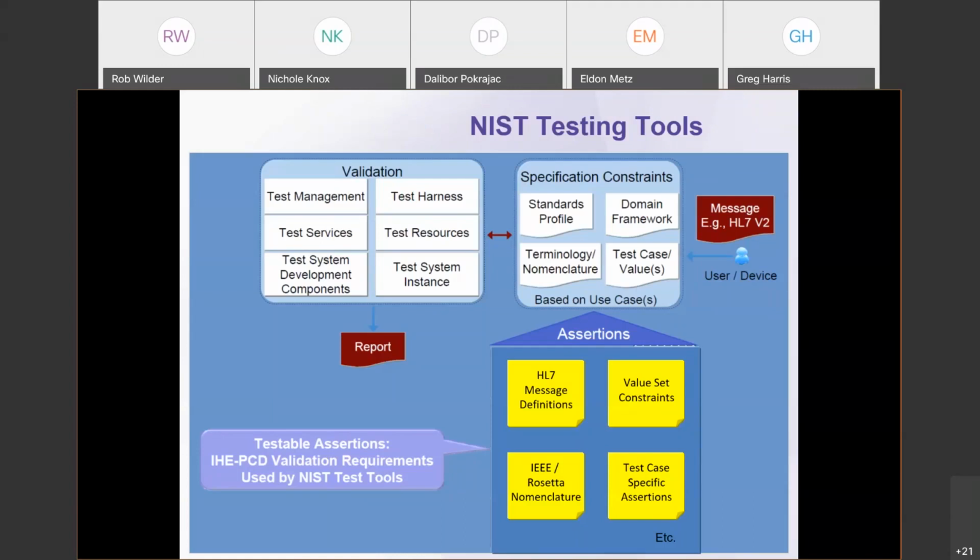The National Institute of Standards and Technology, or NIST, partners with the IHE, and they create independent testing tools for us that allow us to verify proper operations and conformance of vendor-created solutions that use these profiles. These automated tools are available online for implementers to test their conformance to the IHE profiles and ensure partner or vendors can work with them in live implementations.